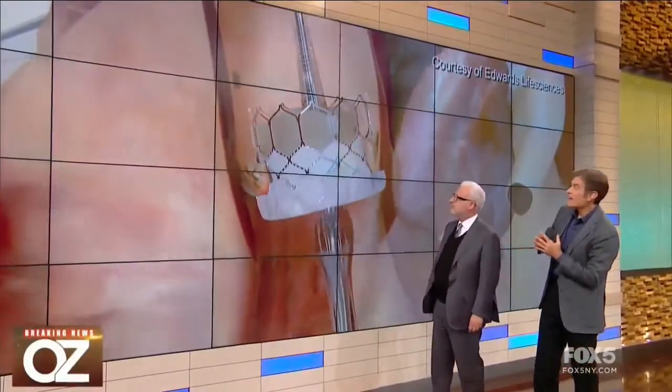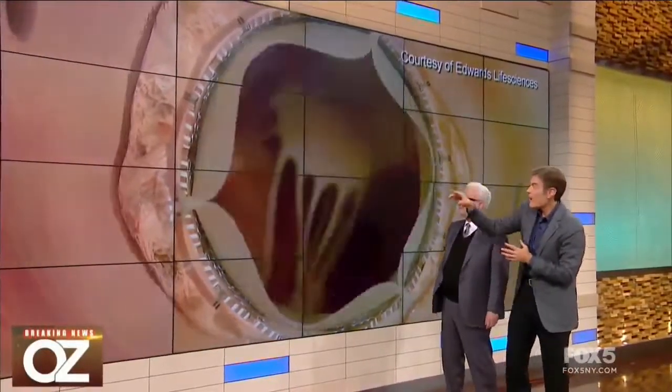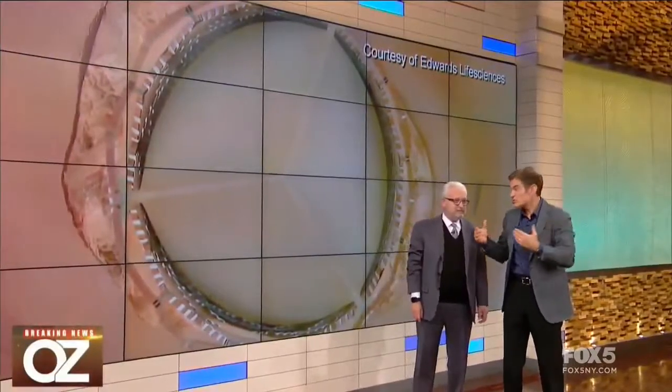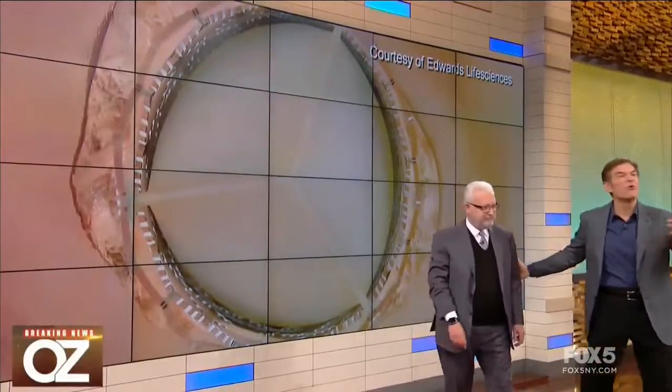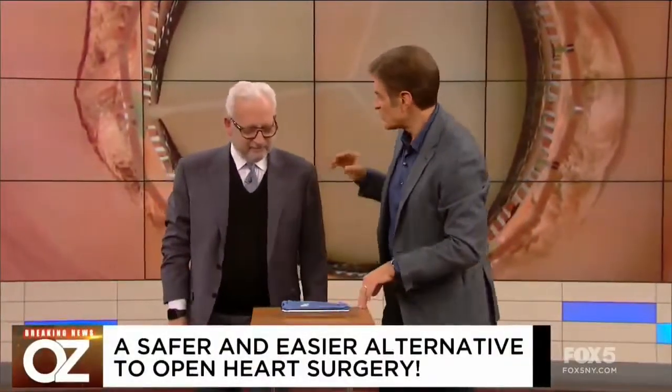And looking at it from above, you'll notice I showed earlier how it got scarred in. Now it's working normally. And one big idea here, which very young doctors shared with us, was you don't have to take the old valve out. You can just push the old valve to the side. It's like mortar, it actually holds our new valve in place. So give us the summary of the results.